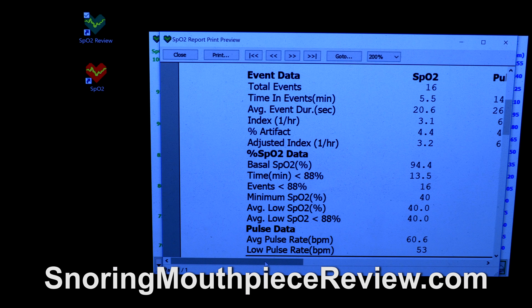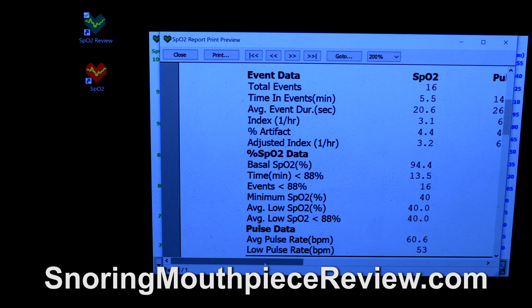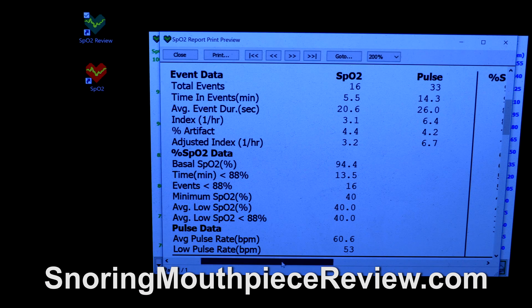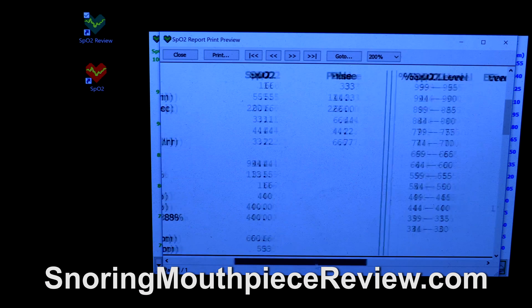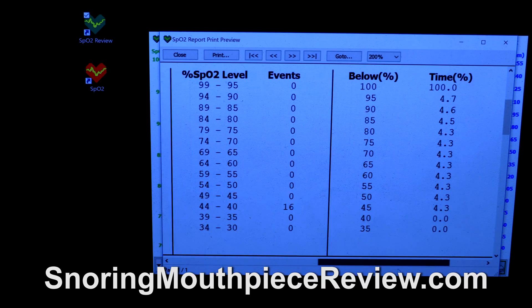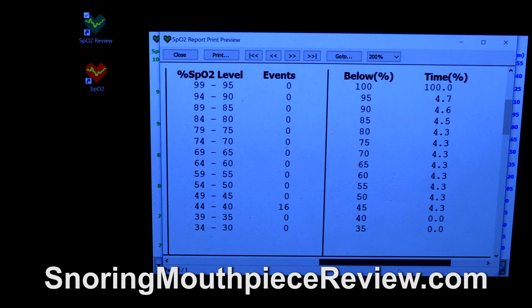This report indicates that the patient had an ODI of 3.1 while they slept. If you have an ODI over 5 per hour, there is a strong likelihood you have sleep apnea. If you have an ODI over 10, there is a high probability you have moderate to severe sleep apnea. Here you can see the oxygen levels which were recorded during the events and also pulse rate events.